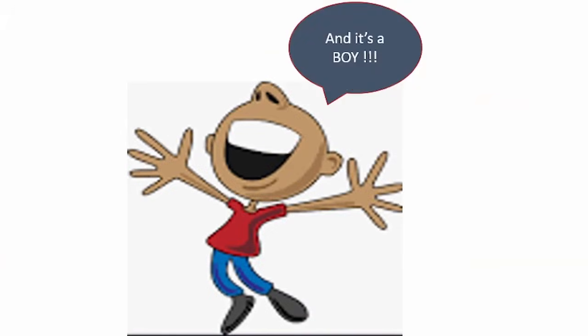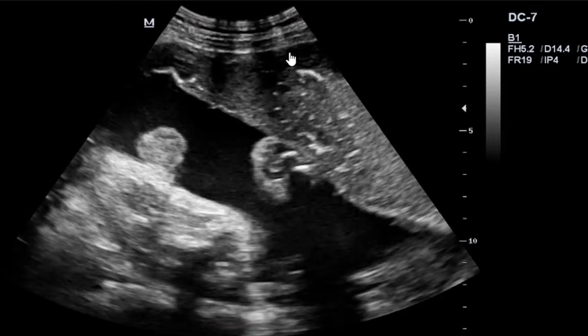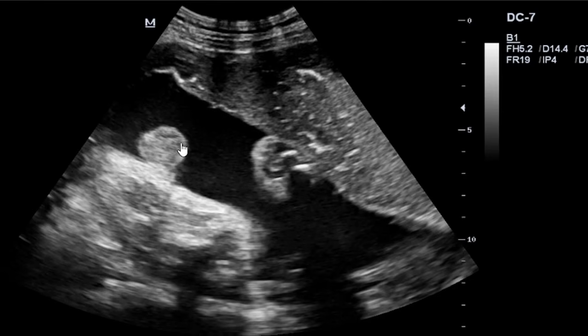In this particular instance, I am going to discuss this case study of a patient I scanned who had a boy fetus. What you're seeing here is the placenta that actually feeds the fetus, and what is here is the fluid surrounding the fetus, which is called the amniotic fluid. Then what we have here are the fetal testicles. So this is an indicator of a male genitalia.